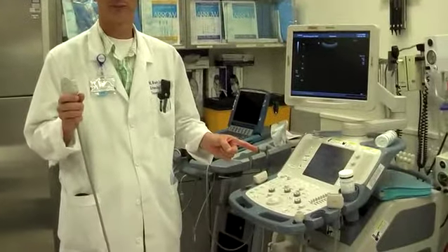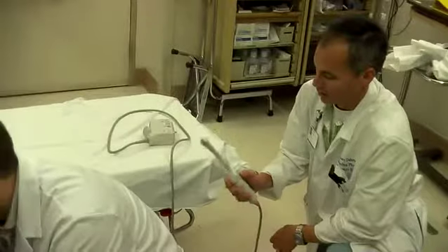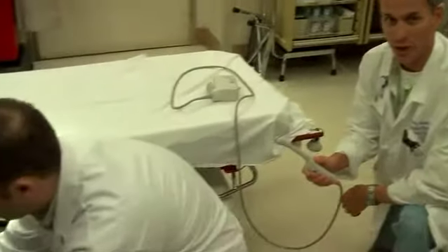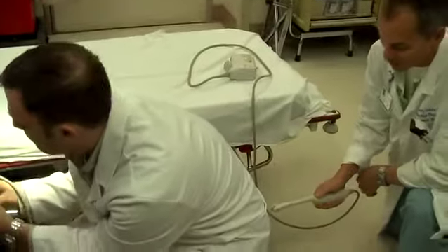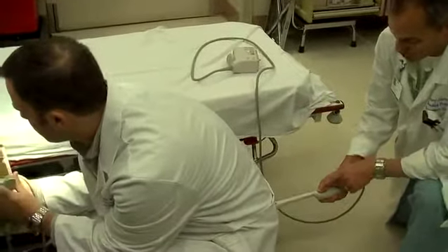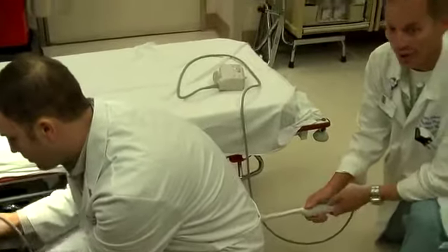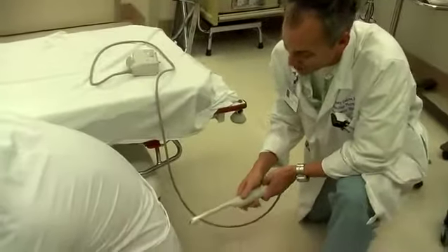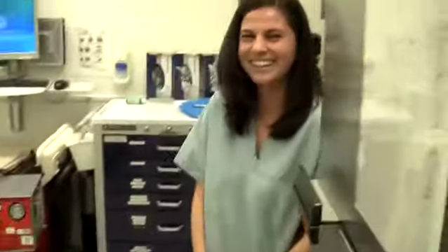This is a high-frequency microcurvilinear probe. You can see the application of the probe is with the indicator in the up portion, kind of like a thumbs up. With that, we'll then gently insert the probe.